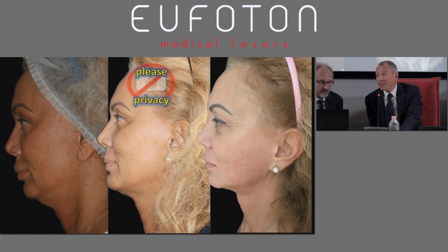We do skin tightening. We do not do any lipolysis. You cannot make the patient look older. If you do lipolysis on that area, the patient will look older.